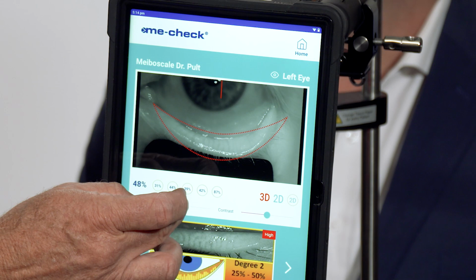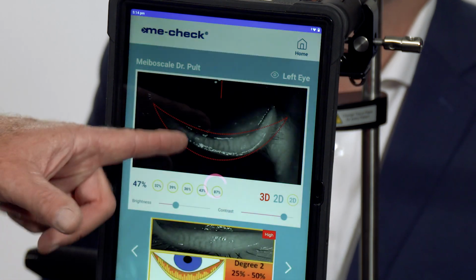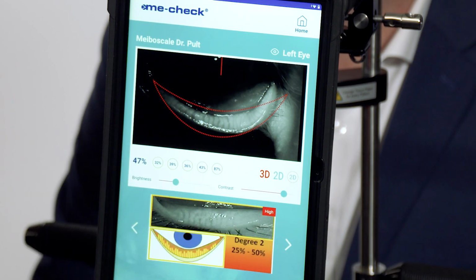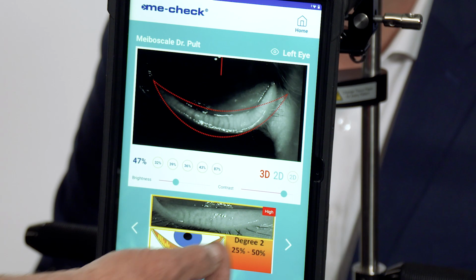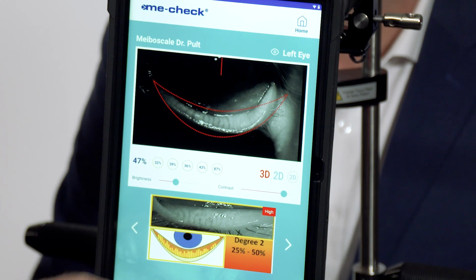So we're going to move the brightness down again a little bit, because it always is a little bit brighter than it needs to be. Move the contrast up. Get really nice contrast of all of his glands here. The instrument in this case got a high measurement. I can see the glands clearly. The instrument calls him a degree 2 as far as his disruption of his glands. We would hit save and proceed.